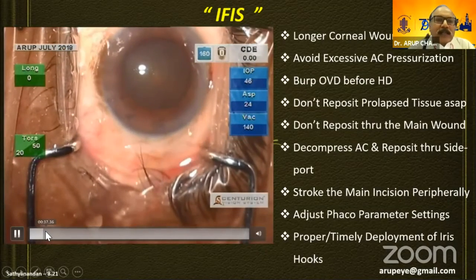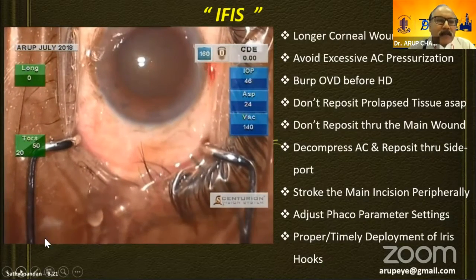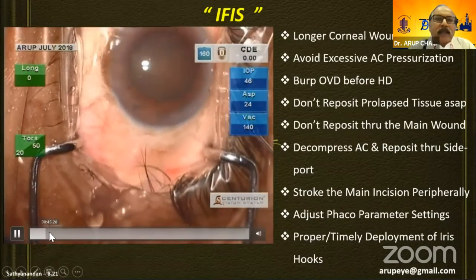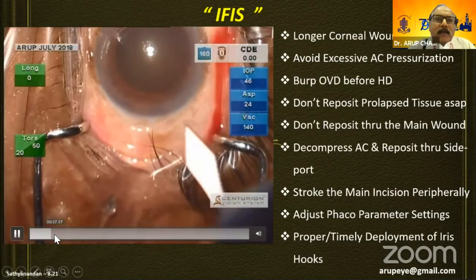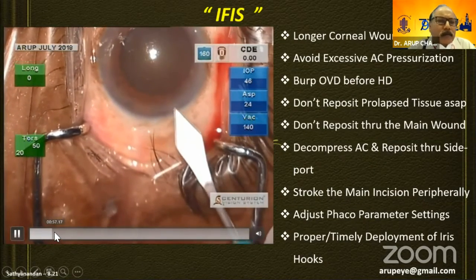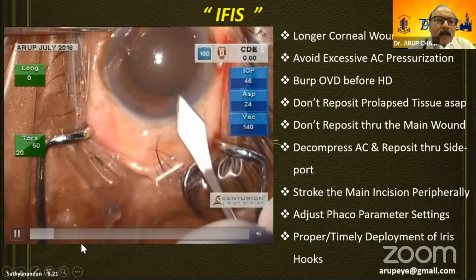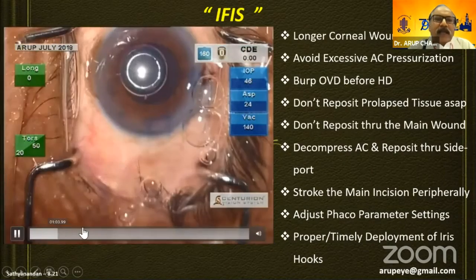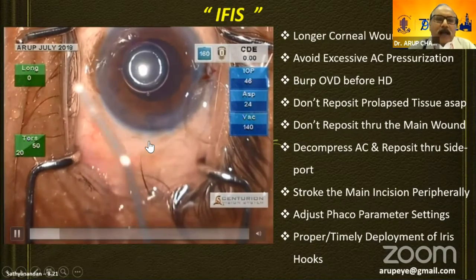This was done, and then I entered the anterior chamber with my keratome, as you will see here. It is a good, normal, ordinary long tunnel, not borderline. After the incision was made, I stained the anterior capsule with trypan blue dye, and the pupil starts coming down. It has already come down.